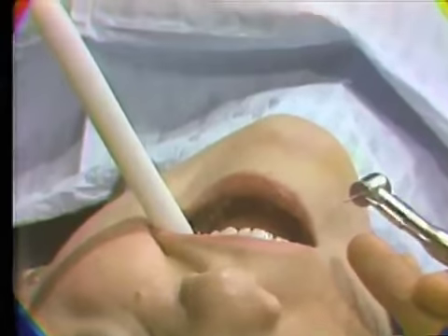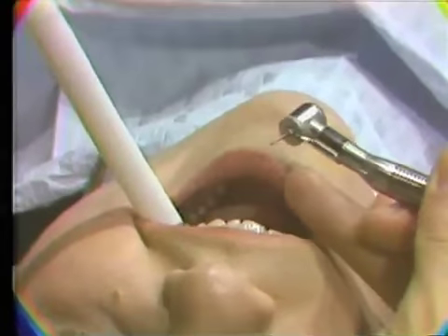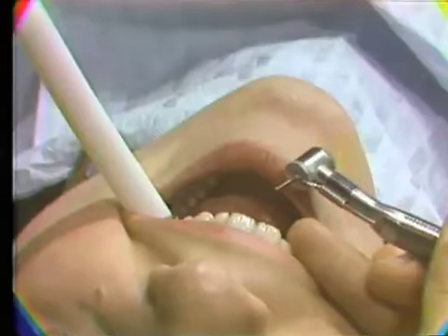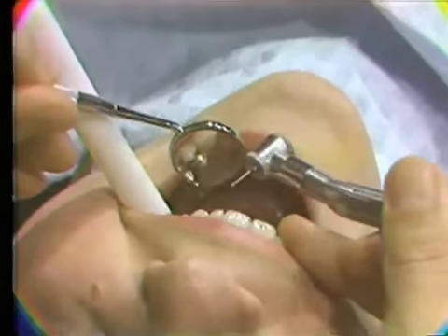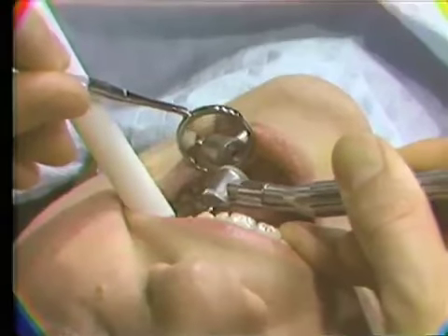Access to the operative site is achieved by having the chairside assistant retract the cheek with the tip of the evacuator. The tip opening should be placed just distal to the tooth being treated and oriented so that the opening is parallel with the buccal surfaces of the teeth. Whenever possible, the evacuator tip should be placed behind the mirror to allow more freedom of movement of the mirror for the operator.